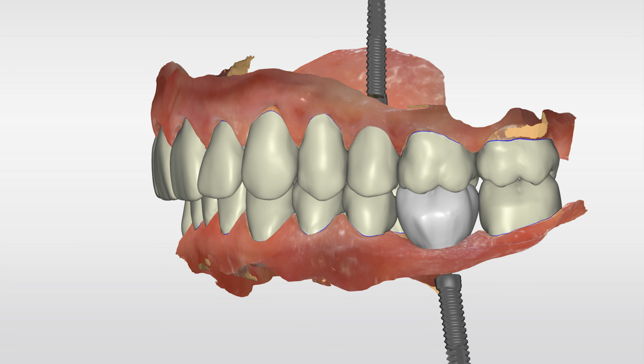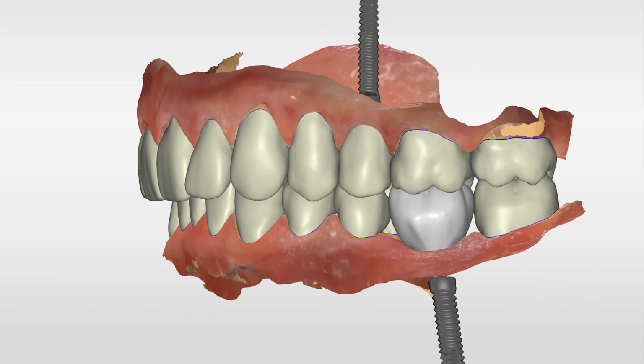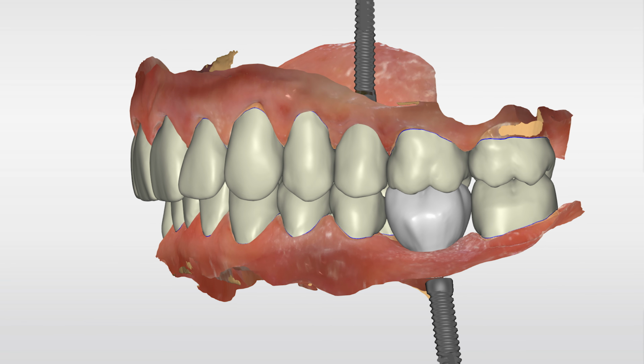So we use those bite blocks in the back to really create the right dimension after we've built that smile, those incisal edges, the edges of the front teeth, to the proper length. We build that up, take some images, and we're able to utilize that to, in software, reconstruct this smile, mill out these veneers and crowns in a matter of a few short hours, and then bond them in same day.